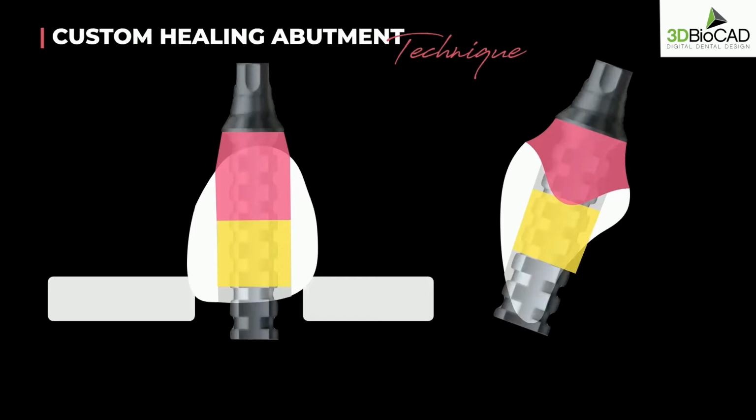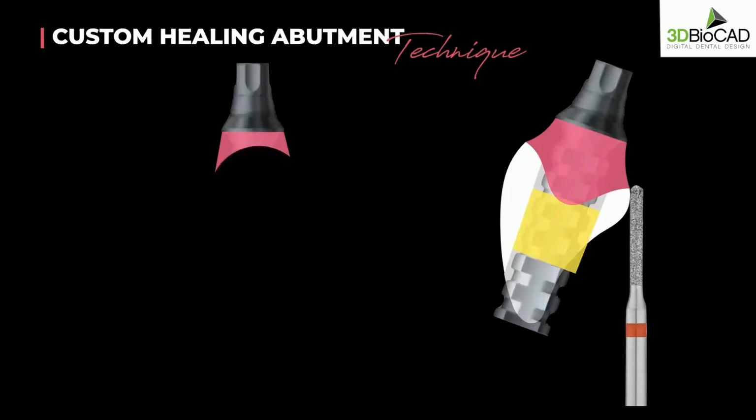By using a different shade of composite to fill in the emergence profile, I can easily identify the junction between the shell temporary and the flowable composite. Then I can adjust right at the junction, or slightly coronal to that junction, so that I know the soft tissue will be supported.